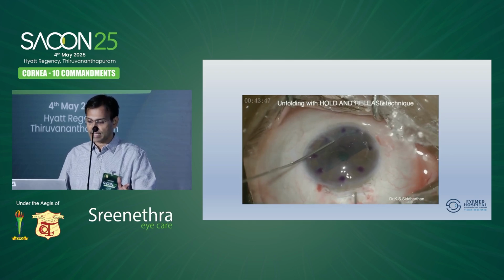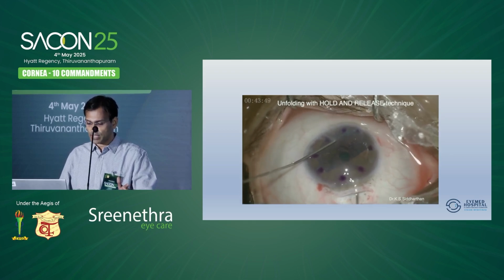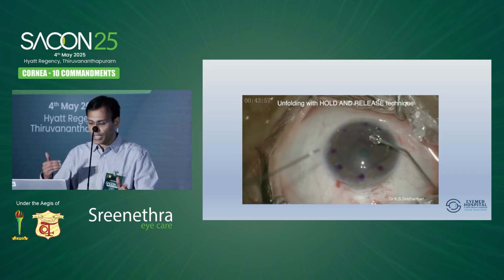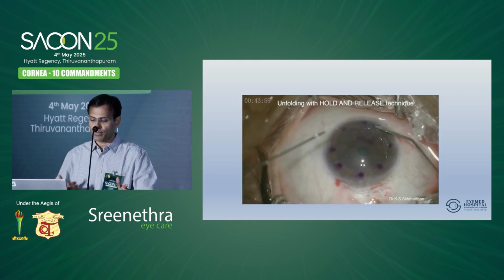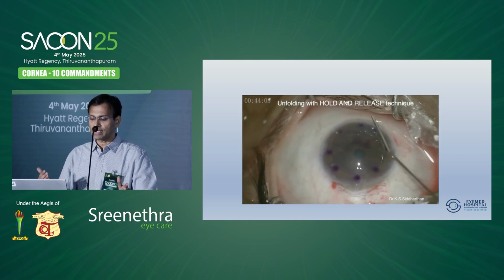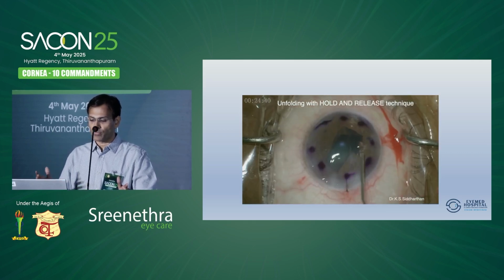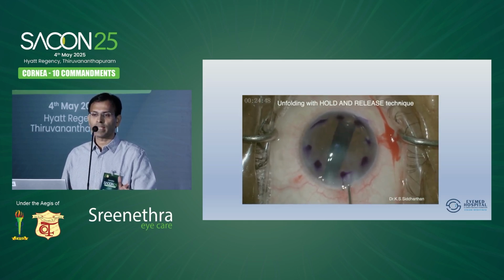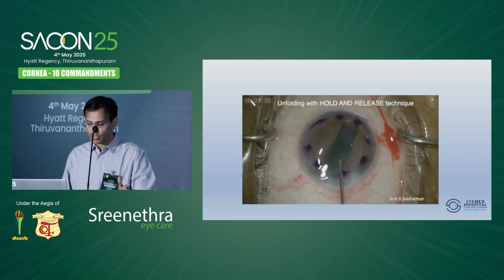Because this is a scleral tunnel, I didn't put a suture, but you see that I inject saline, see it comes out. By gravity, you inject saline and you shallow it. As the water comes out through the tunnel, the graft unfolds. And just gentle tapping, no violent tapping. The thing in these cases is, again, when it is unfolded, try to make it mostly horizontal. Shallow the anterior chamber.